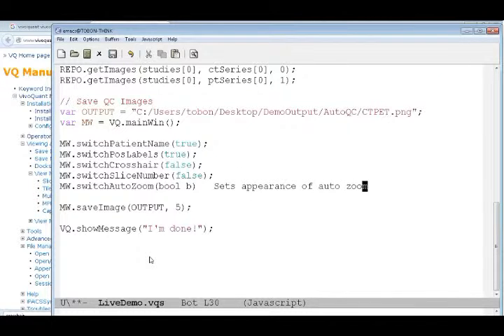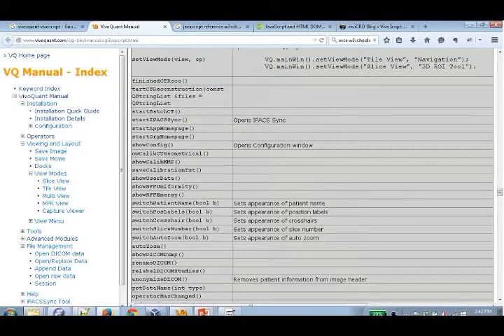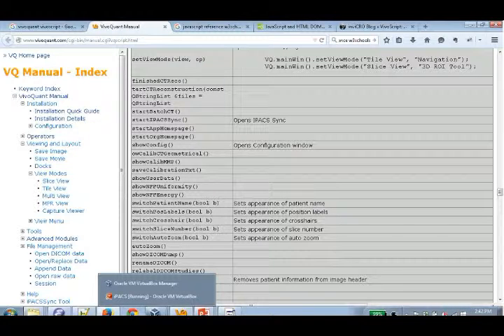It would, for instance, be possible, we have done that in the past, to write the VivoScript that produces this code for you. And it's possible to output text from VivoScript. So if you have to do this very often in different configurations, you could just write code that looks at your current settings and then write out code that reproduces that again. That's something that we've done occasionally. Great. And that comes closer to the macro operation that we were discussing earlier.